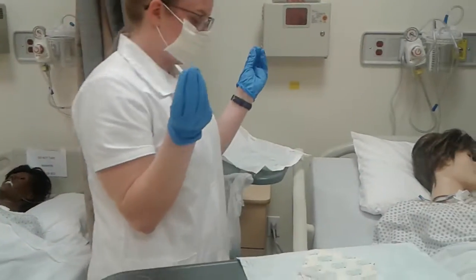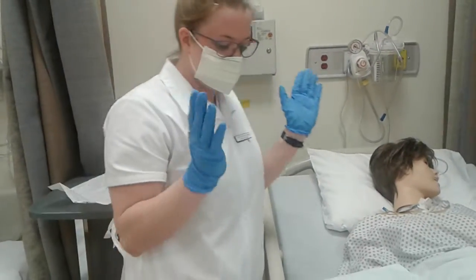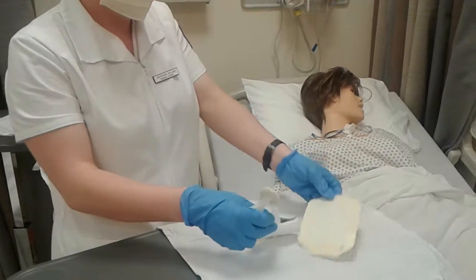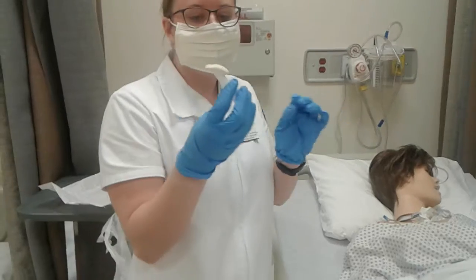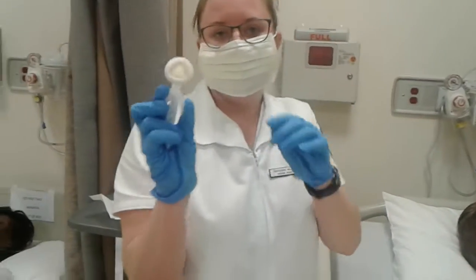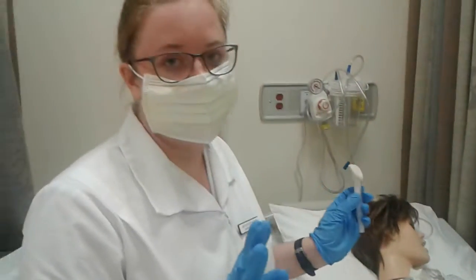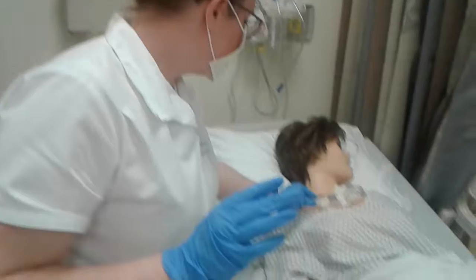So now that I have my sterile gloves on, I'm going to move this aside, and I'm going to open all of my materials inside my central line kit. So I have my ChloraPrep applicator. I'm going to crack the two sides, allowing the fluid to flow onto the pad, and I'm going to cleanse all of the skin around the central line dressing in vertical and horizontal strokes.